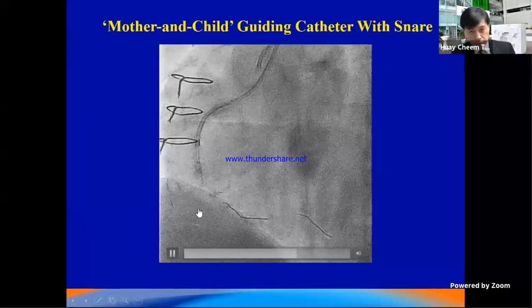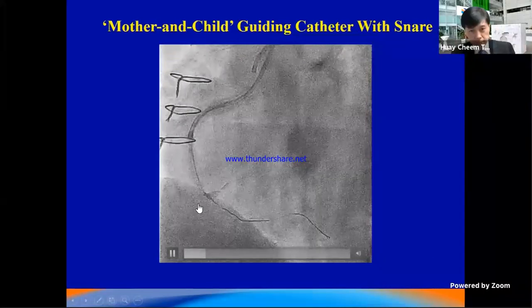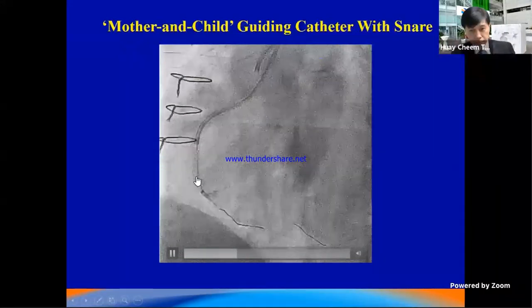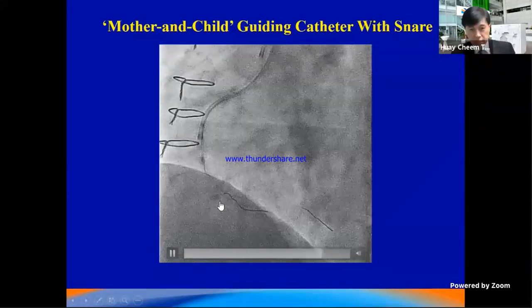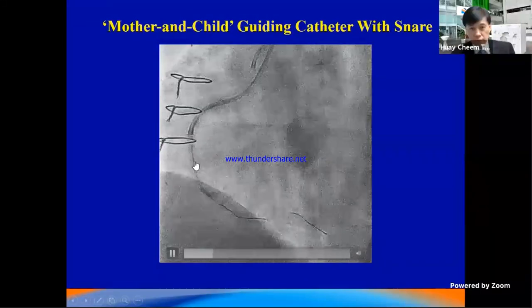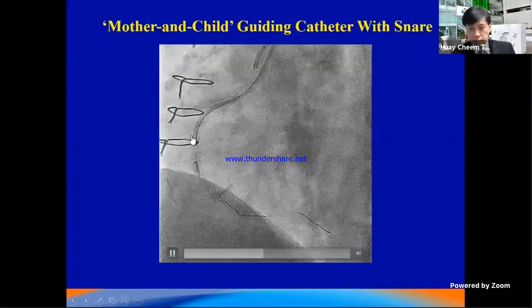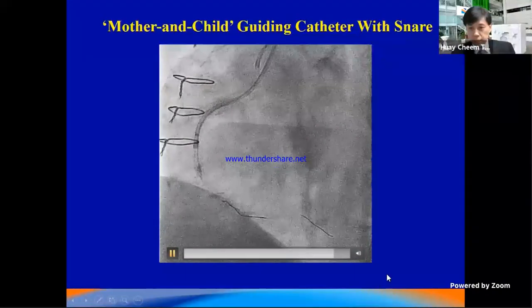Did you see what happened towards the end of this procedure? I want you to take a closer look at this burr as it comes back halfway through. What is happening here is that the burr got intertwined with the stent and part of the stent was stripped off from the distal end of it, leaving the proximal part of the stent that is still endothelialized. So the stent got stuck here.